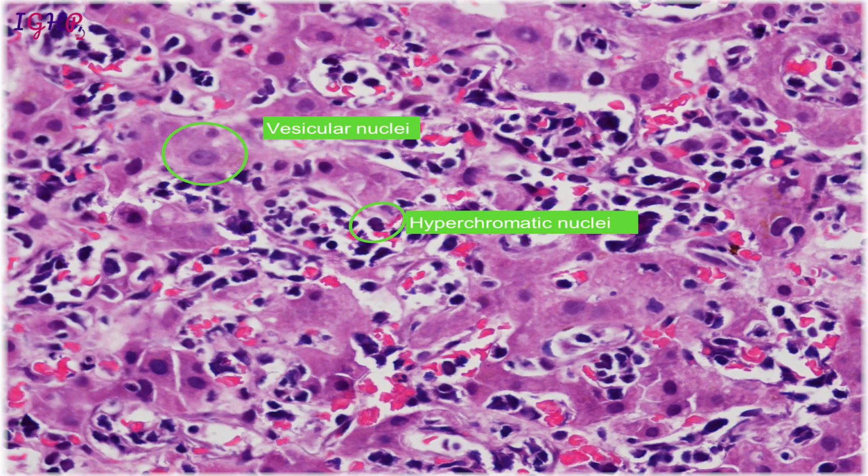The next type of cells that we see in histology are these areas. If you see these cells, these are very distinct from the cells that are seen here. These cells are very hyperchromatic, very darkly stained, as opposed to these cells which are lightly stained. So these are the hepatocytes which have a vesicular nuclei, and in the vesicular nuclei you are seeing a nucleoli, and these are the normal actively dividing cells.